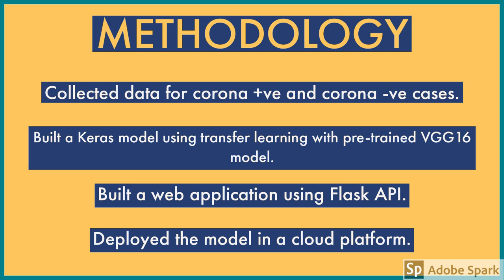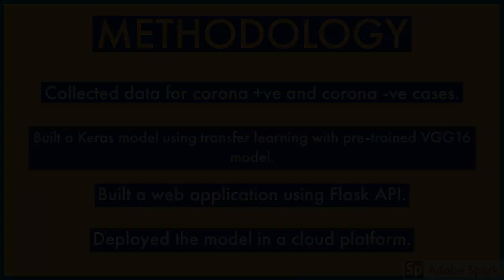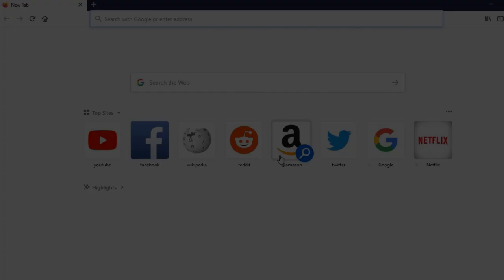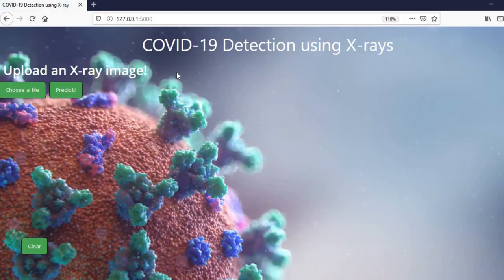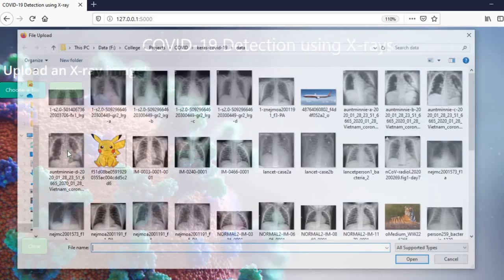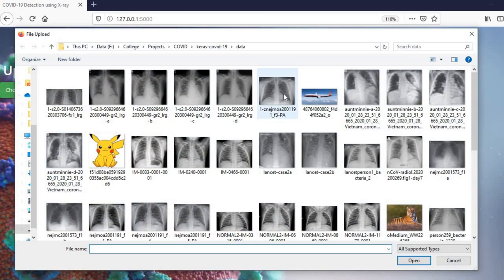What we are going to see is the implementation of the same model. Based on the trained model, we have developed a web application to predict if a person is affected by coronavirus or not. Now, let us predict some instances to check the model. We will predict on a random image.